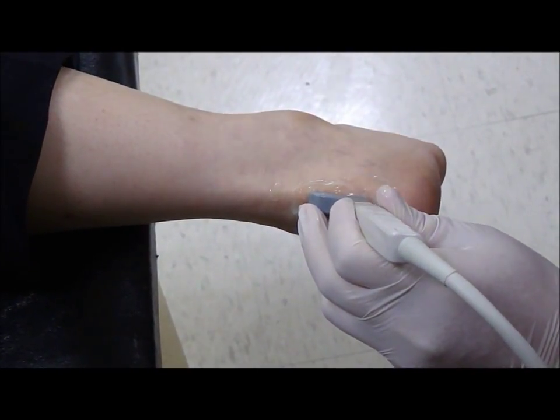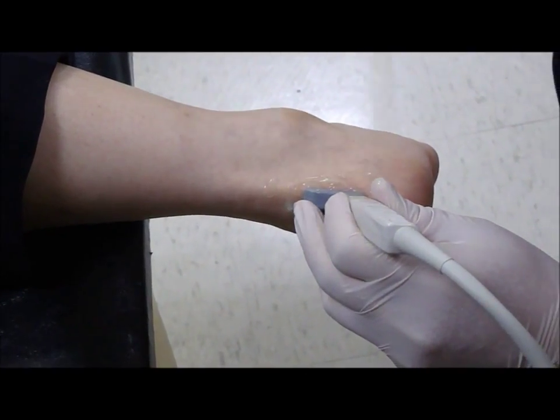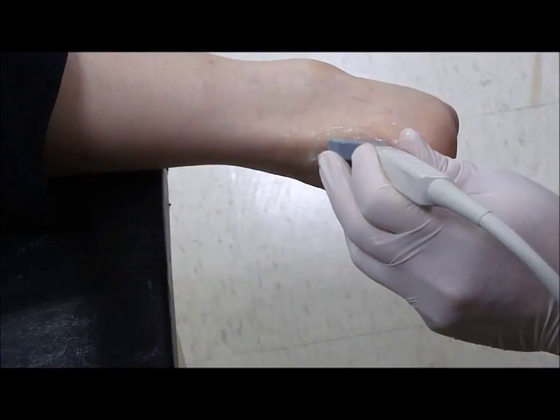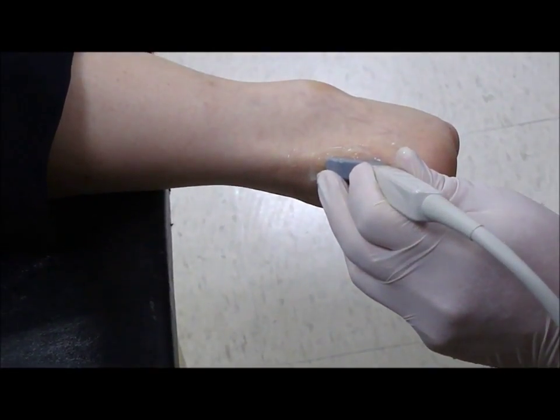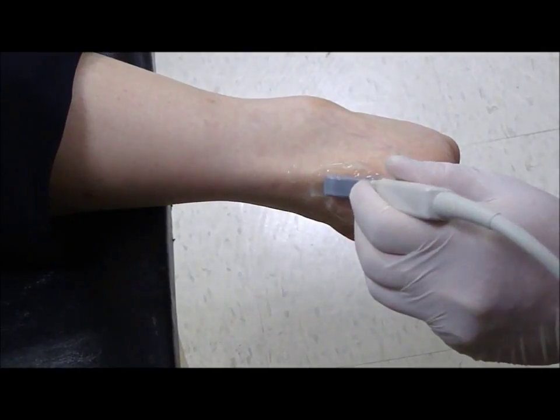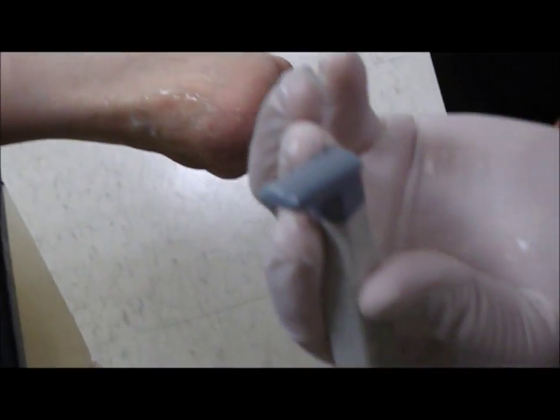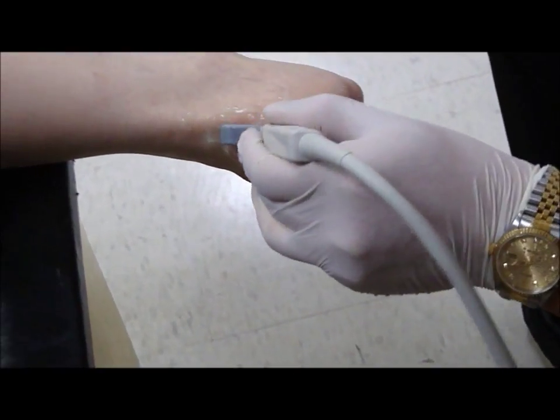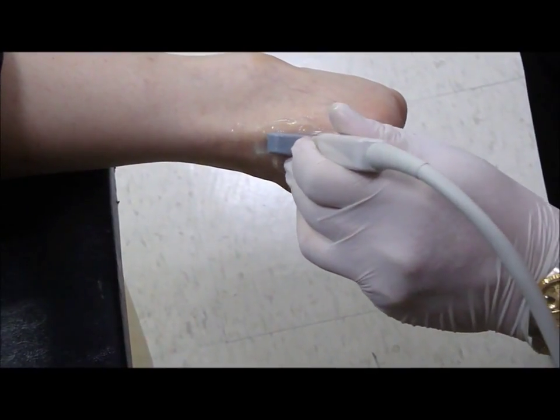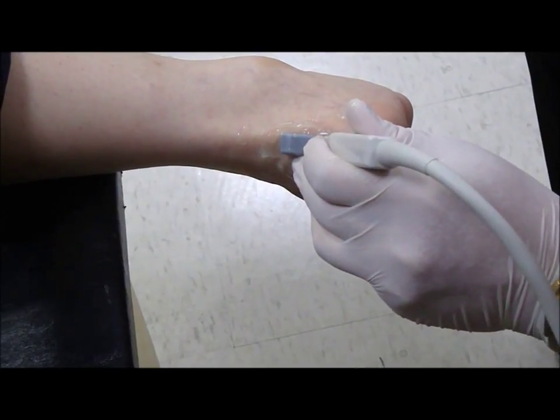This is the sagittal view, or the longitudinal view, of the Achilles tendon and the retrocalcaneal bursa. We recommend the usage of a smaller head of the transducer probe. Again, this is the longitudinal or sagittal view to see the retrocalcaneal bursa.